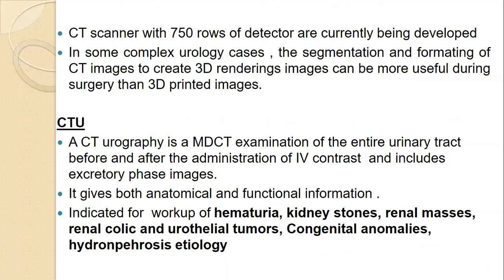In some complex urology cases, segmentation of the CT images to create 3D rendered images can be more useful during surgery than 3D printed images. So at SIUT we are doing 3D images.